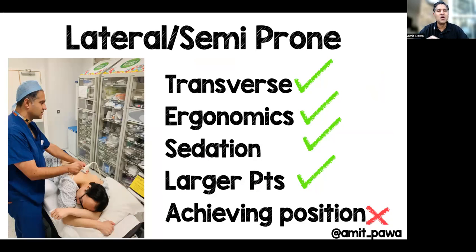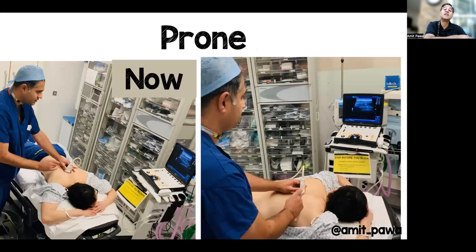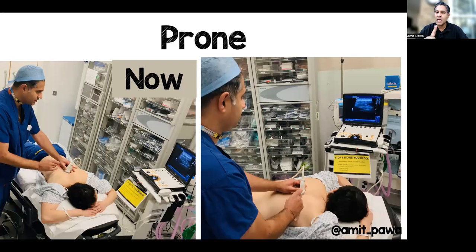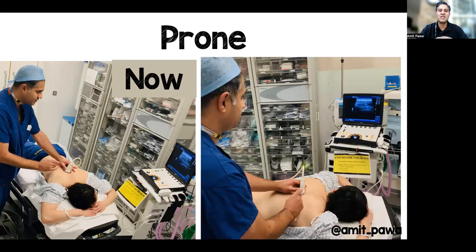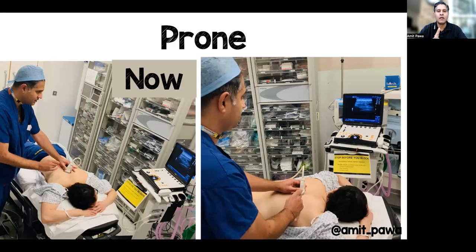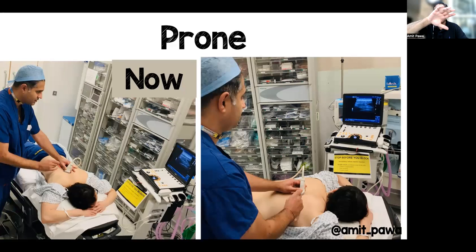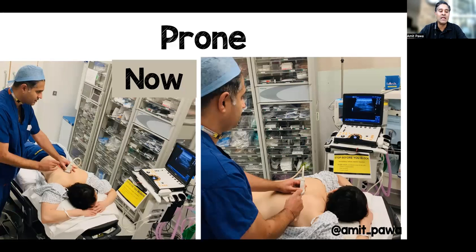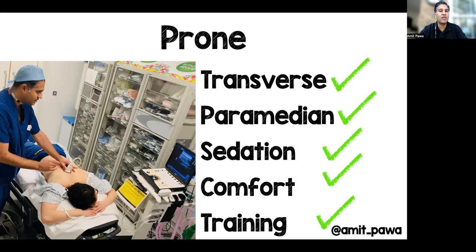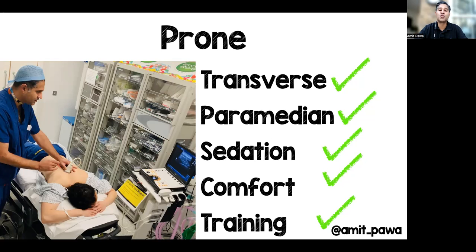What I struggled with was explaining to patients how to get into the lateral position — they often found it challenging. So now I have reverted to having patients in the prone position, which is where I prefer to do most of my paravertebral blocks. The key is to get the patient to abduct their arms so it brings the medial border of the scapula away from the midline. Putting a pillow under the chest helps get a bit of thoracic kyphosis, which can aid with block insertion.